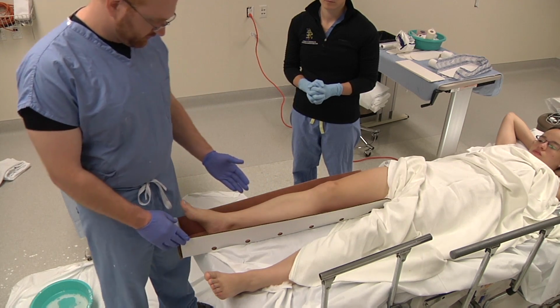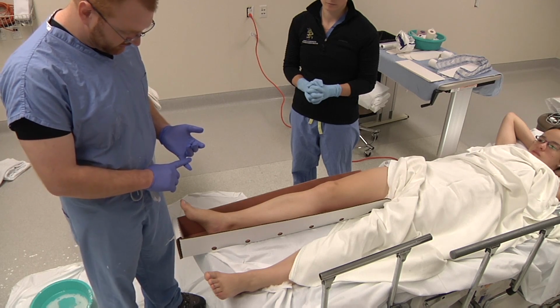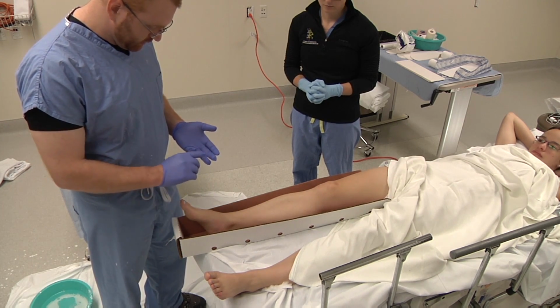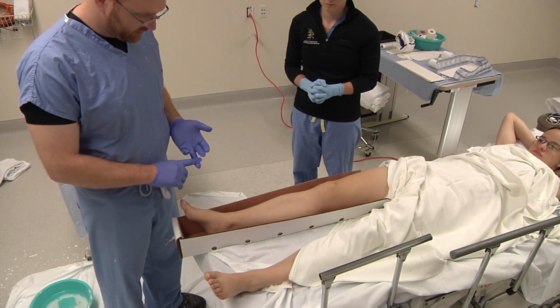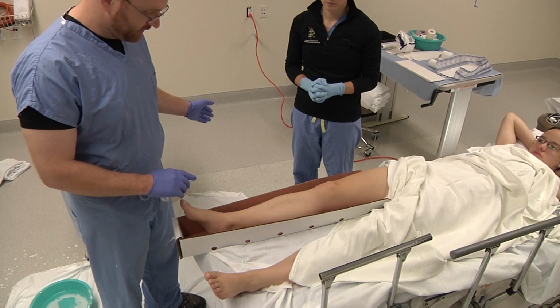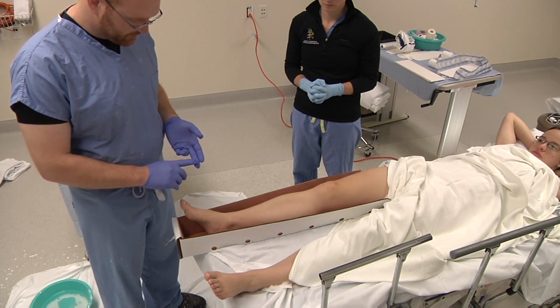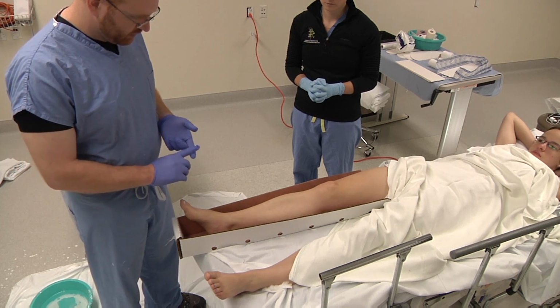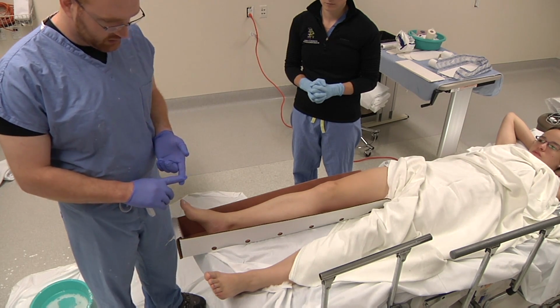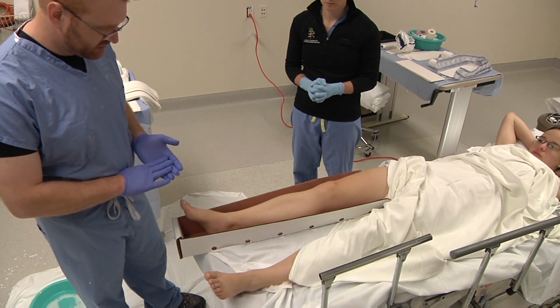As always, before any splinting, make sure that you have done a thorough neurovascular exam, including ABIs if that's applicable. You have reviewed your x-rays to determine what your deforming forces may be. You have all your splint material readily available, any C-arm if you need that to evaluate your fracture while you're splinting. You have got appropriate analgesia for the patient, which may include IV or oral medications, conscious sedation, or hematoma blocks.